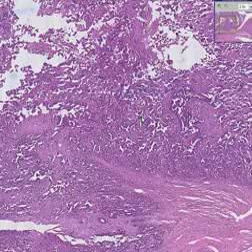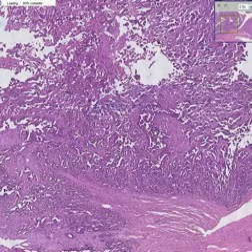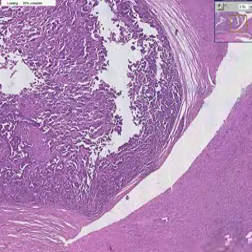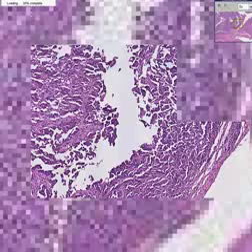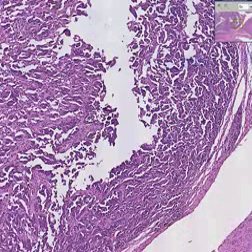And in addition, it's not called papillary, but I think if you kind of look around a little bit, you will almost imagine that some of these structures do look like they might be forming little papillae, like here, and like here, and like here. But after all is said and done, let's keep it simple. Adenocarcinoma of the ovary.